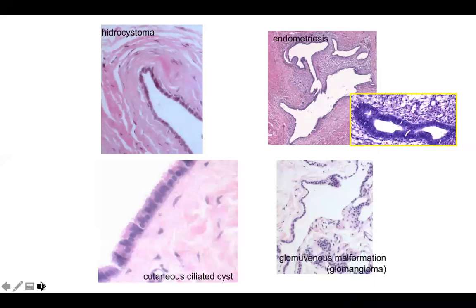Hydrosystoma has square cells that contain round nuclei, and here and there a layer of oval nuclei at the outer border. These oval cells are myoepithelial cells.